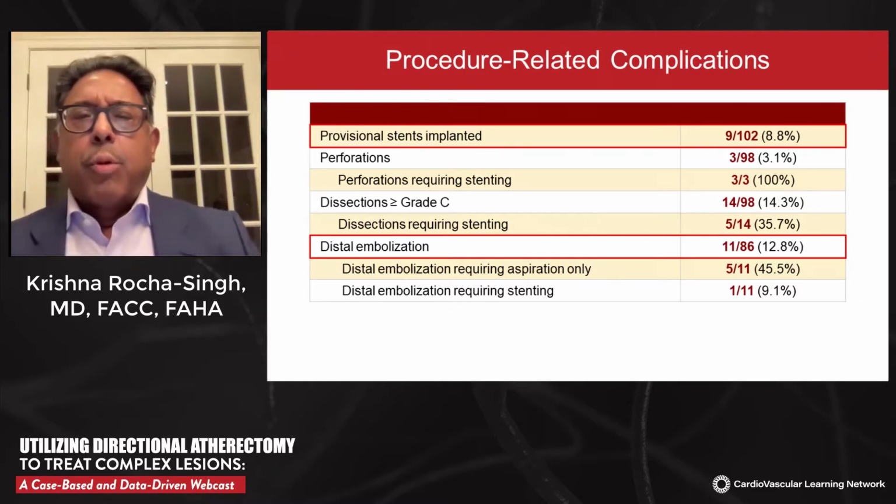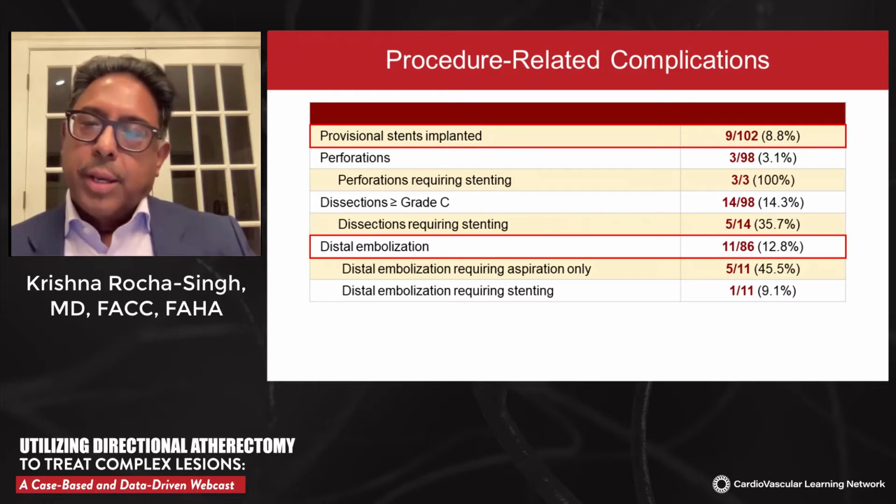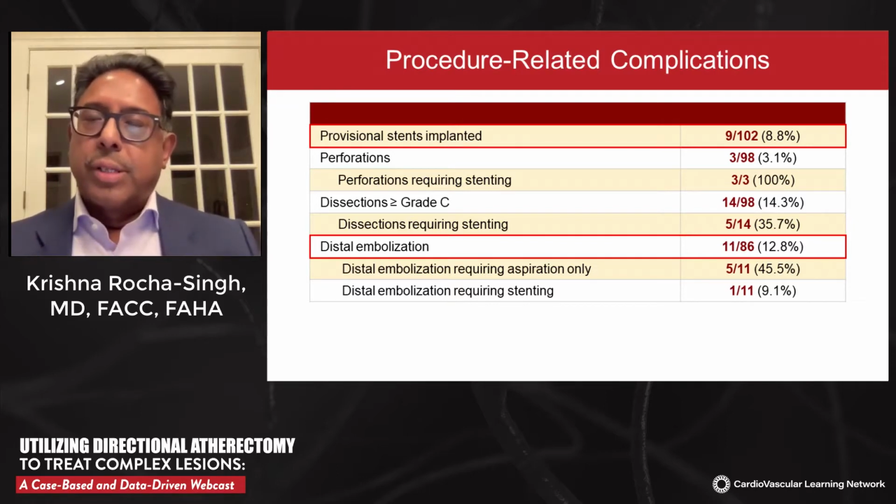So I think this is very important, and it calls out the importance of the use of distal protection devices. I can suggest to you that in no case was the distal protection device removed during the procedure and a second distal protection device used. And in only one case was a distal protection device not used.